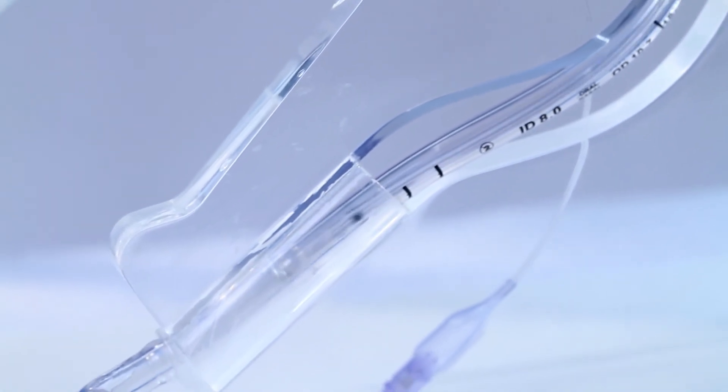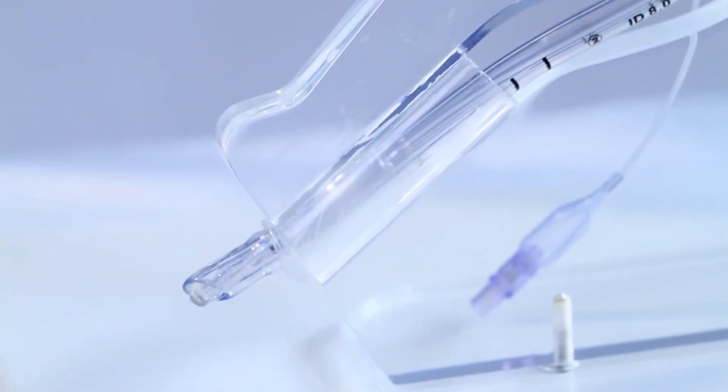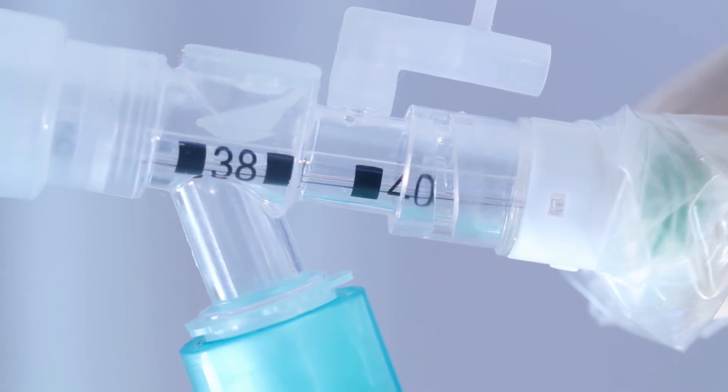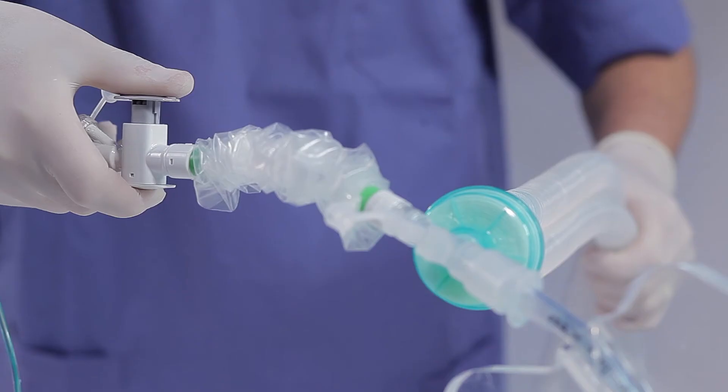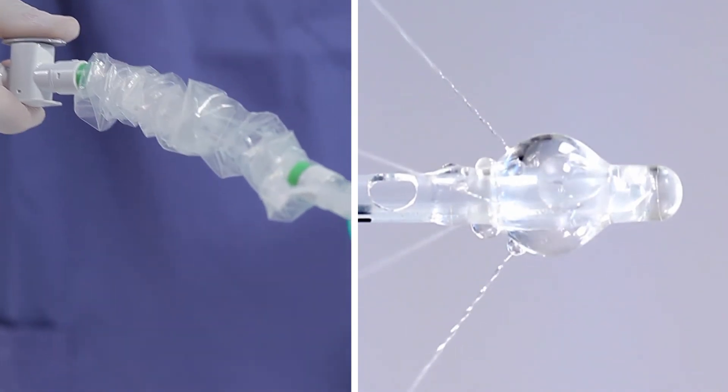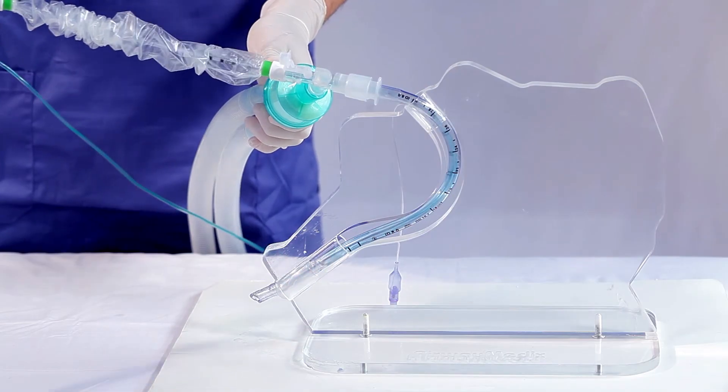Insert the catheter into the endotracheal tube and advance it to the desired depth. Make sure you advance no further than the third bold depth band, which is visible in the clear window. Press the thumb control valve on the handle and simultaneously withdraw the catheter.